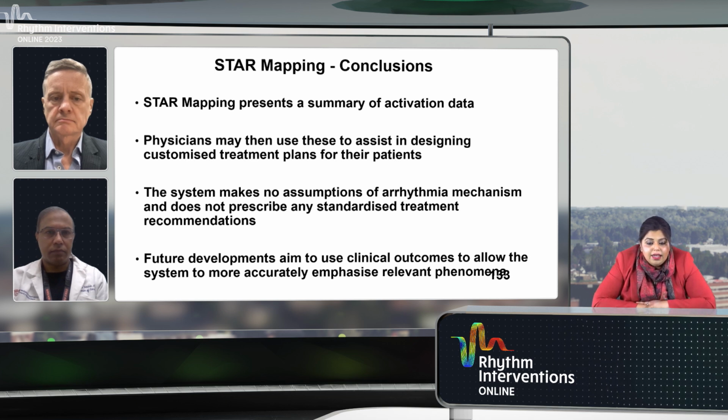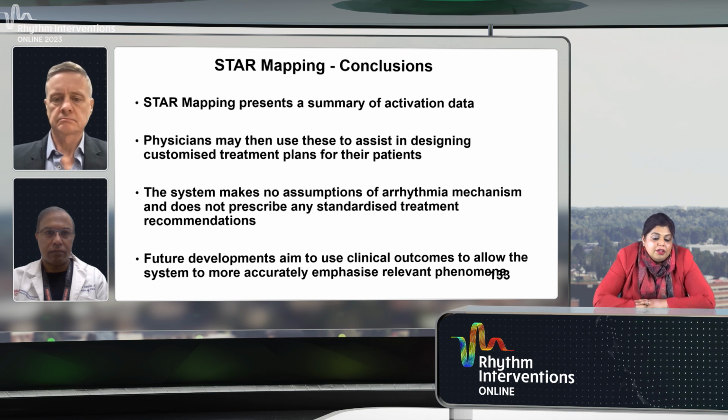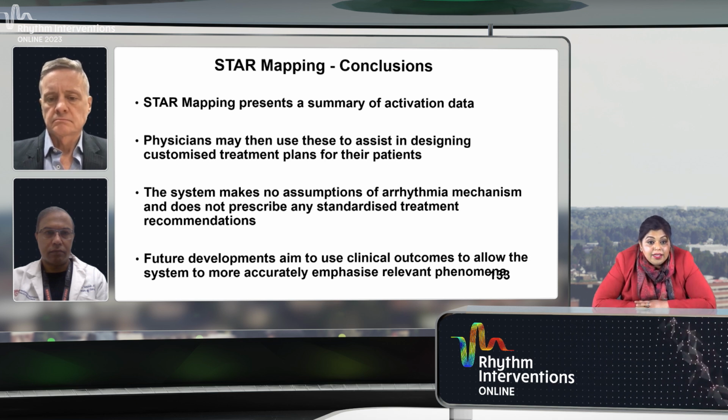I think the system gives me a summary of activation data. I think it helps design a more customized treatment plan, like you saw in our case. And like Richard said, it doesn't make any assumption on arrhythmia mechanism, and does not prescribe any standardized treatment.